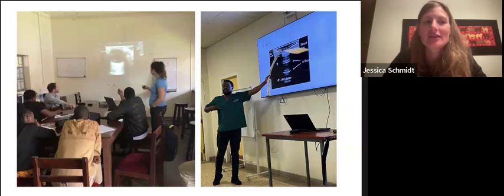Another part of technical considerations, and this is a slide from Dr. Christine Macbeth, is thinking about where you're going to do your teaching in your facility. And we all have done this. We've tried to either crowd everybody around a laptop, trying to see a small ultrasound machine, or project ultrasound images onto a wall where it's not a dark enough room. So obviously we don't all have the advantage of having some really nice TV screen like you see here on the right, where the images show up beautifully. But I think when you're thinking about your needs assessment and you're thinking about how you're going to implement your trainings, thinking about some of these things ahead of time are important so that you can maximize audience engagement so they can actually see the things that you're trying to teach.